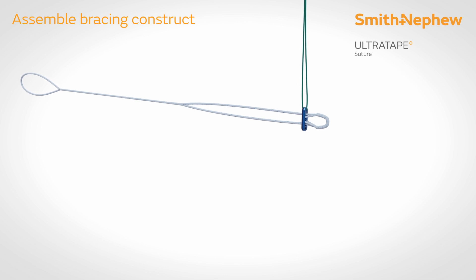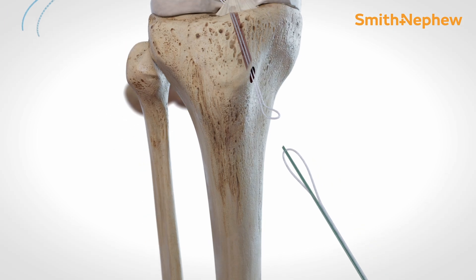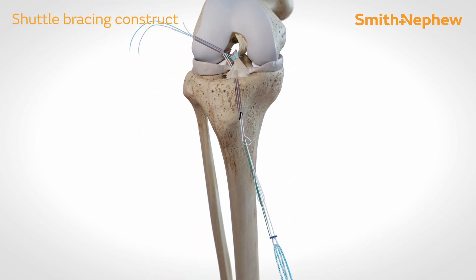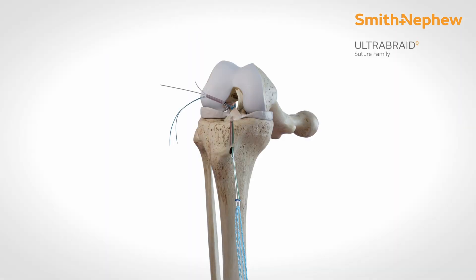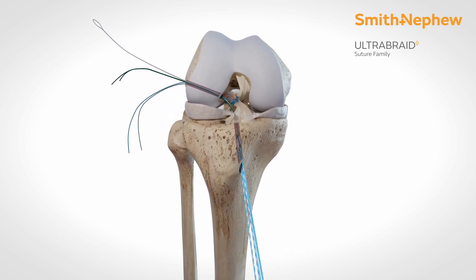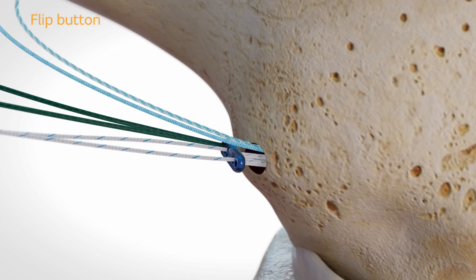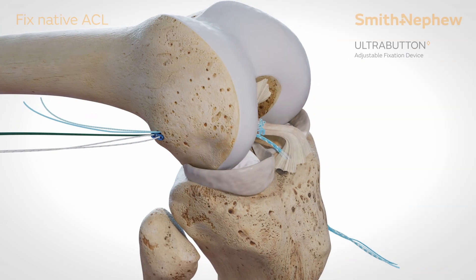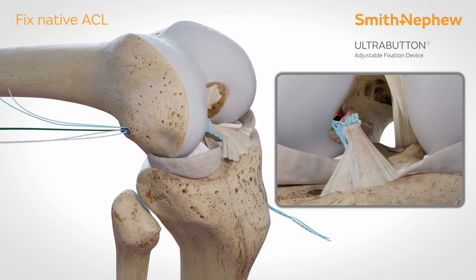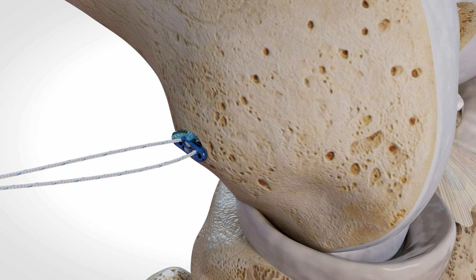Assemble the ACL repair bracing construct by loading two ultra-tapes onto a reduced ultra-button. Load the bracing construct and begin shuttling it into the joint. Flip the ultra-button. Fixate the construct by pulling the ultra-loops and then tying them to the ultra-button.